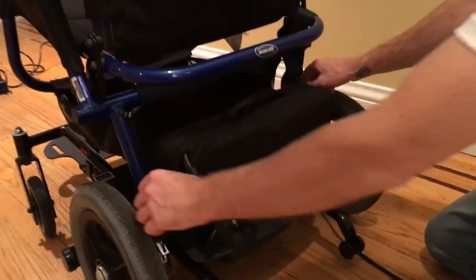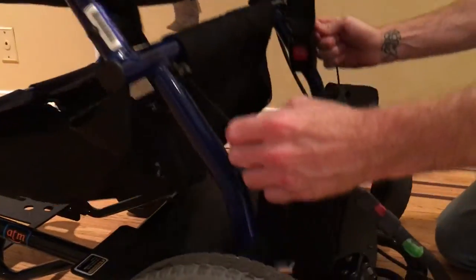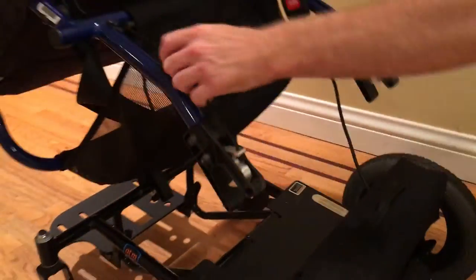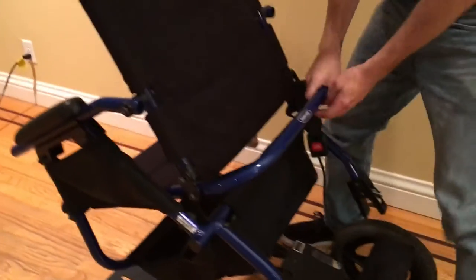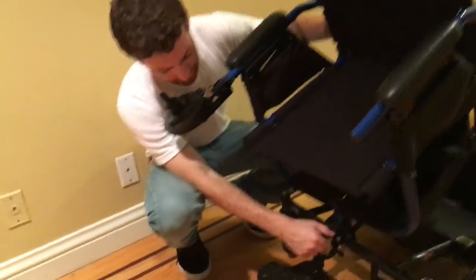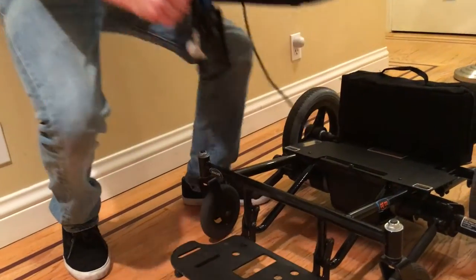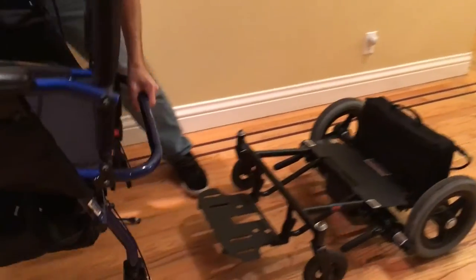Next, we have these strings that take off the chair from the axle. We want to go around to the front and lift up on this tab, and that will detach our chair. Set that aside.